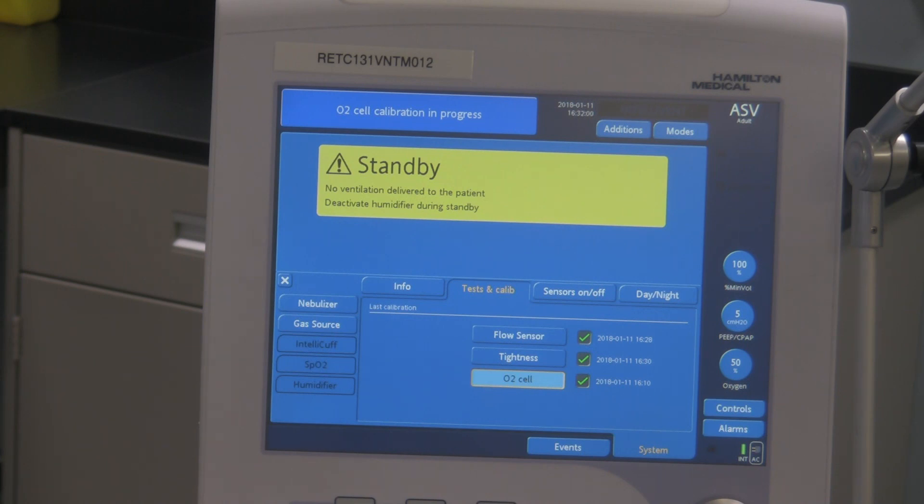Now we also have C2 ventilators as well. The C2 is a close relative of this ventilator here, but the Hamilton C2 ventilator is a transport ventilator, whereas this ventilator is not, per se, a transport ventilator.